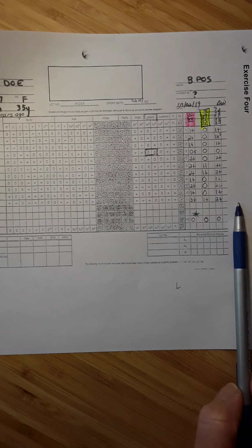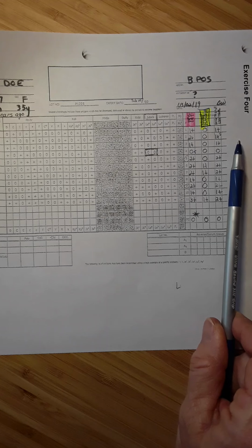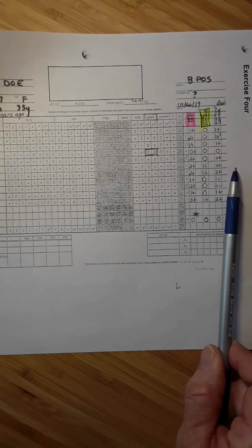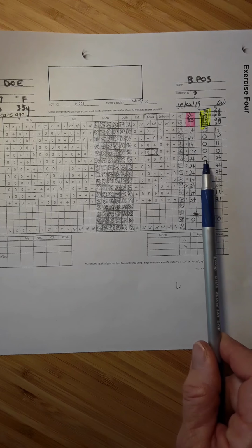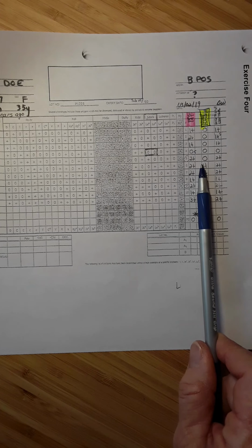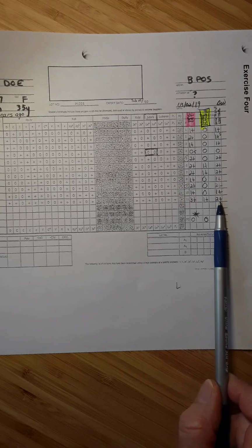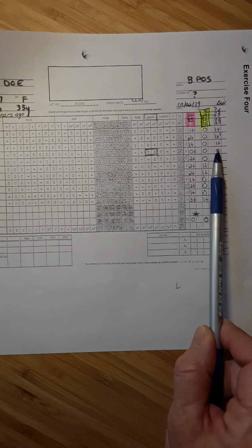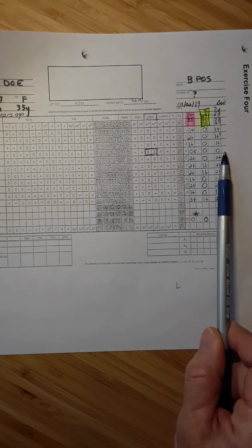So again, we would need a bunch more free plasma from the patient, and we would add, instead of the neutralizing substance, we would just add saline to that in the same proportions as we would add the neutralizing substance to a vat of plasma as well. So this is just a dilution control. And these results should be very, very similar to our original results. Okay, so just diluted out a little bit.